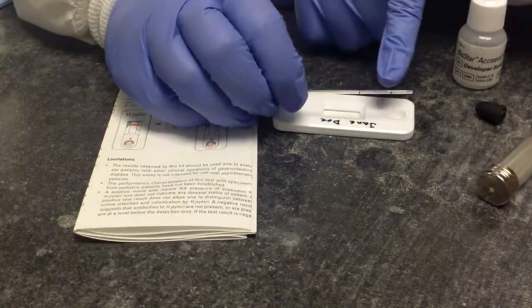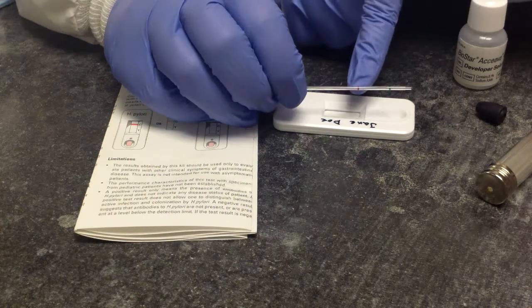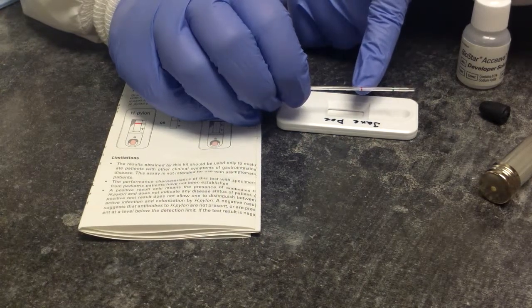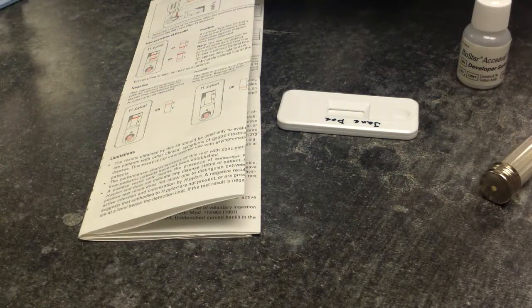And if you can see, there's a green line and a red line. The green line is going to be used if we use serum. The red line is going to be used if we're using whole blood. We can actually draw this directly off of a finger stick and do the test directly from a finger stick. Many of these EIA kits work that way.